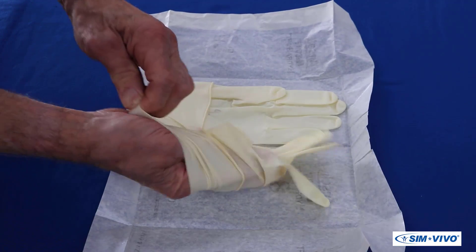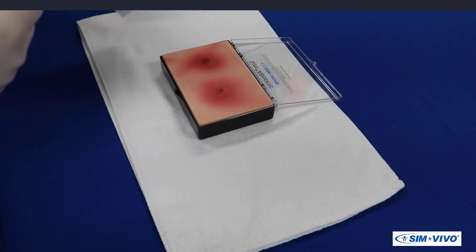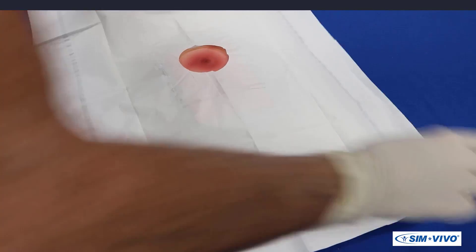The first step is to put on gloves, as you will practice the sterile technique required to complete the task. Your assistant will open the drape package, unfold it, and place it on the trainer with the abscess exposed through the fenestration.